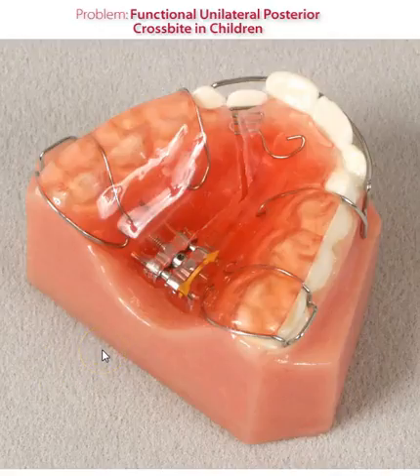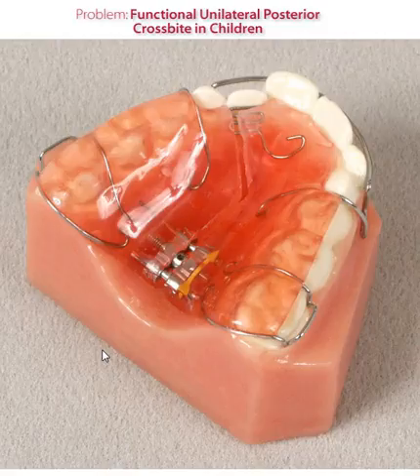This is a very common appliance used for a unilateral posterior crossbite. Traditionally, most doctors will say that a true unilateral crossbite is very rare. It's usually due to the constriction of the maxillary arch. The mandible either shifts left or right to accommodate some type of bite, so many doctors will expand bilaterally to allow that mandible to come back into a proper relationship.